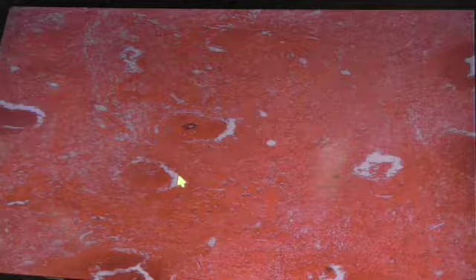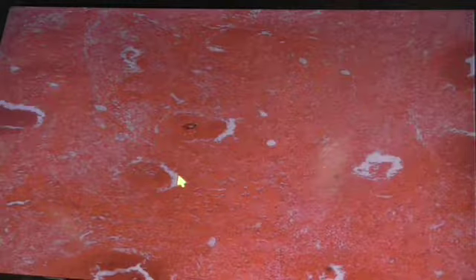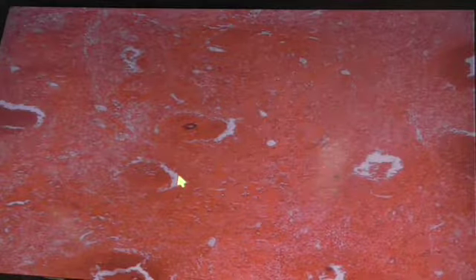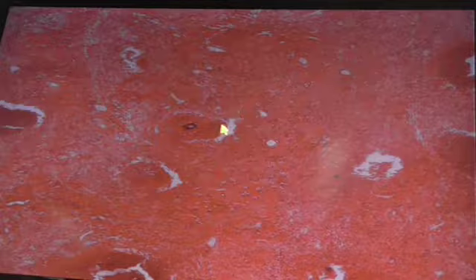All right. So neutrophils in tissue, do they release lytic enzymes? Yes. And so in the form of an abscess, are you likely to see what kind of necrosis there? Liquefactive. So liquefactive necrosis is a clear space, the tissue is missing, is gone. So all these were collections of neutrophils releasing substances, and you got the dissolution of the tissue.